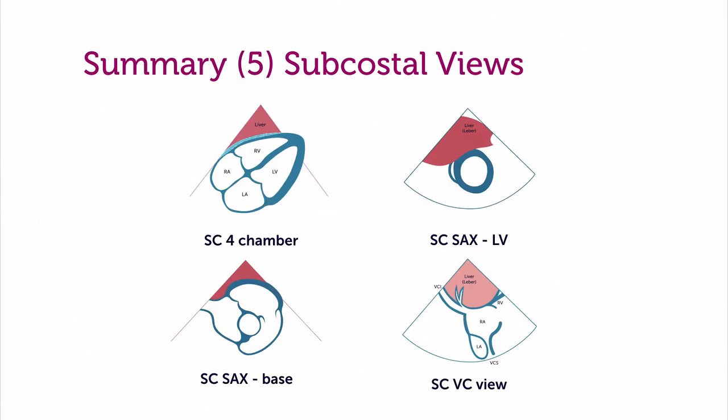When it comes to the subcostal view, we're using a 4-chamber view. We can rotate around this view to also get short axis views, for example, at the level of the ventricle, but also at the level of the aortic valve. This view is ideal to look at the pulmonary artery. And then finally, the subcostal view is very important to image the IVC.